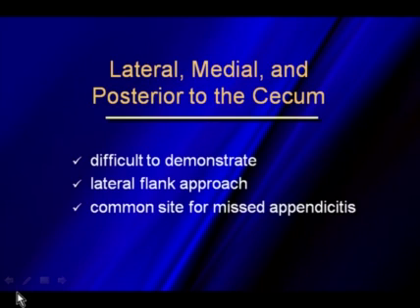If we still haven't located the appendix, we'll go back up to the cecum. As I mentioned earlier, this is a difficult area to find the normal appendix. I have not seen a normal retro-cecal appendix yet. I have diagnosed cases of appendicitis that are retro-cecal. Occasionally the appendix can be lateral to the cecum, so you want to make sure that you look not only medial but scan lateral to it, and rolling the patient up into a decubitus position may be helpful to look for an appendix that possibly could be retro-cecal.